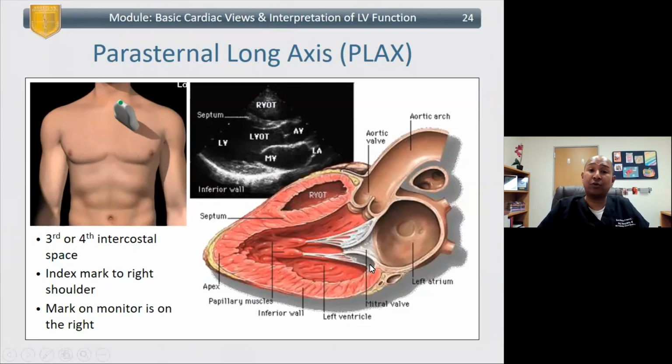I think the parasternal long axis view is the classic view when you're doing cardiology questions. They want to explain the physiology of HOCM, hypertrophic obstructive cardiomyopathy. This is a great view they always show where you can really see the septum being very hypertrophied in certain cases. So you should be very familiar with this view and match up these anatomical locations with what you see on the ultrasound.